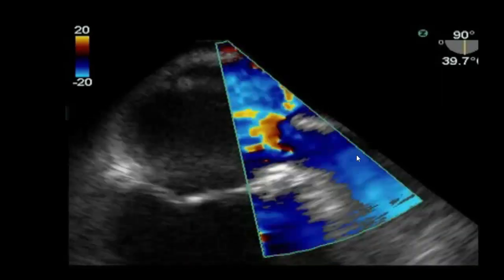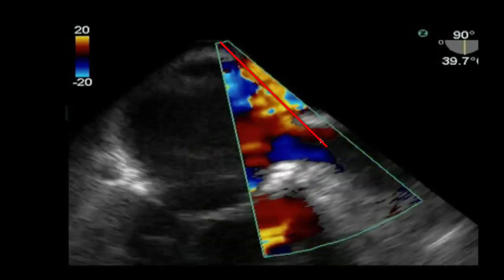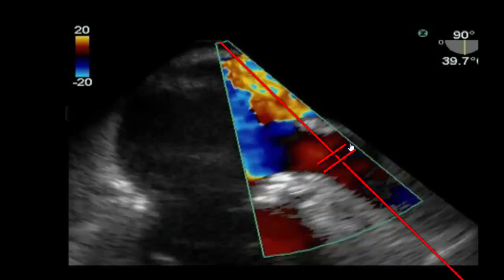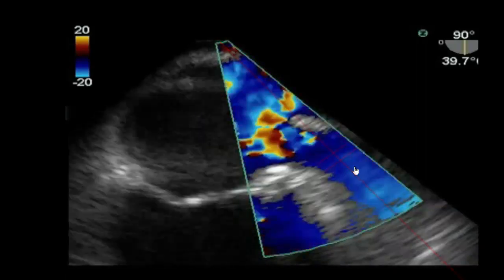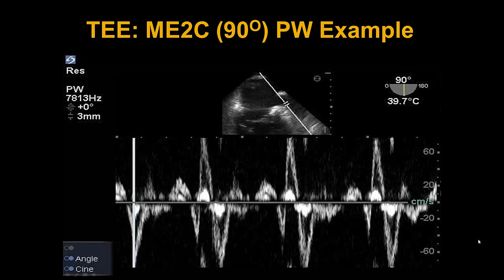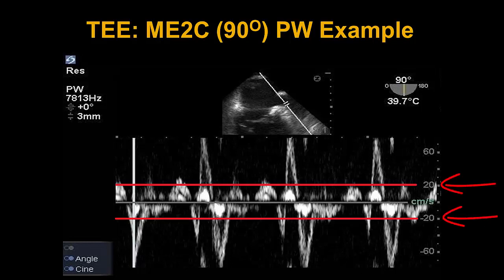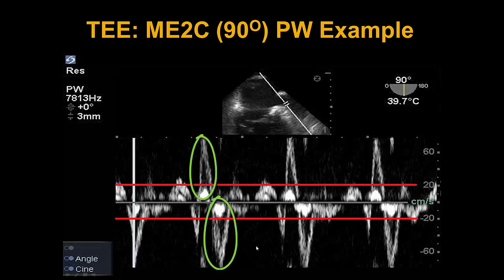Last but not least, we place a pulse wave Doppler into the left atrial appendage to analyze the spectral Doppler signal. We place our sample volume into the left atrial appendage. We have captured the spectral Doppler signal by pulse wave — these are examples of normal flows seen from the left atrial appendage. This is reassuring because we use a cutoff of 20 centimeters per second, indicated by the red lines above and below the baseline, and the flows are much larger than that cutoff, indicating these flows are less likely to be niduses for clot formation.